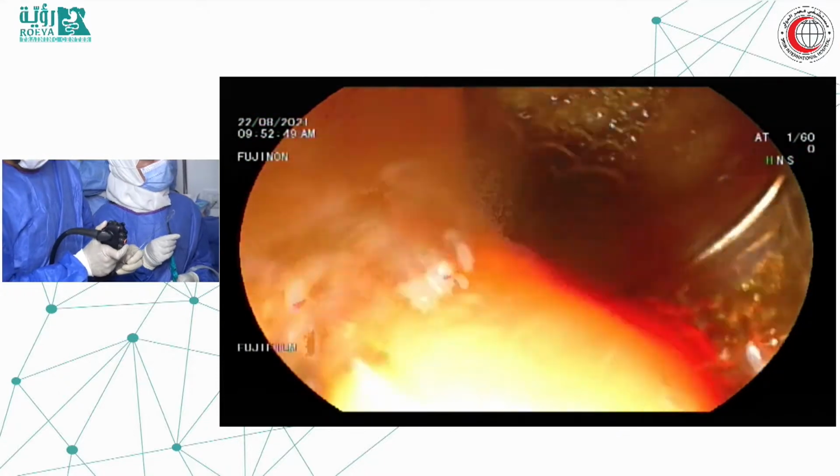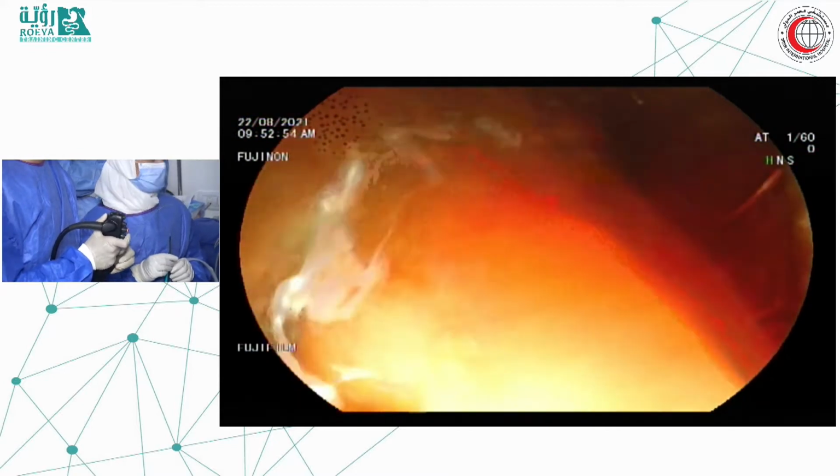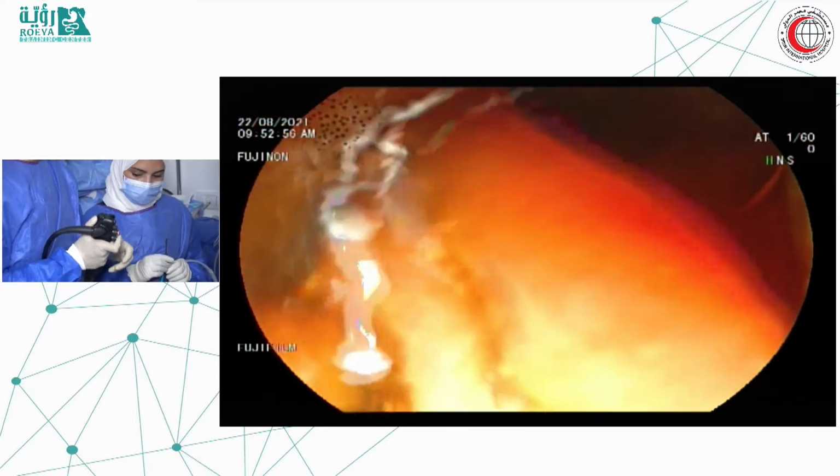Can I have Buscopan, please? Thank you. Okay, there is a little bit of peristalsis. I will inflate a little bit. We need just to see.